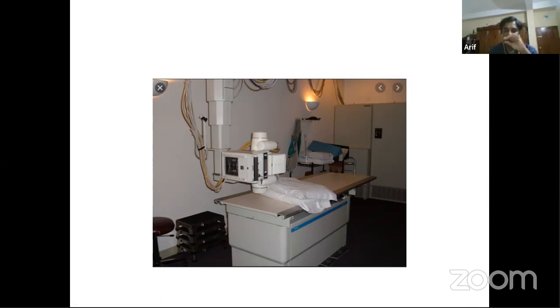Please ignore that. But I am telling about the situation in my country and in my place. What you can do in this situation: you cannot put the X-ray tube down towards the floor, or you cannot just move the X-ray tube as much distance as you can.